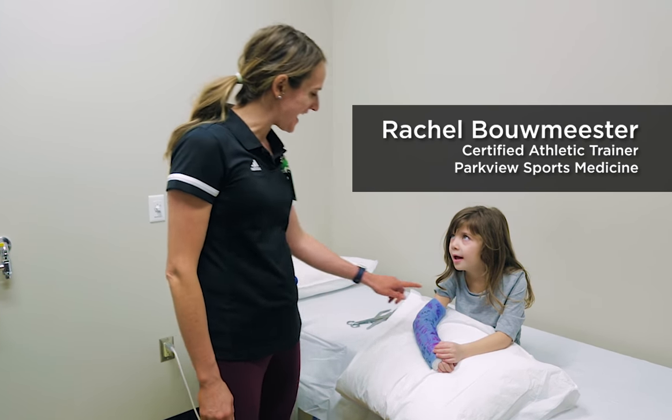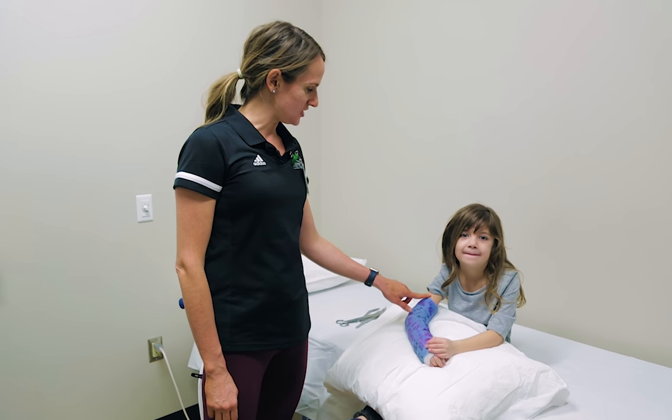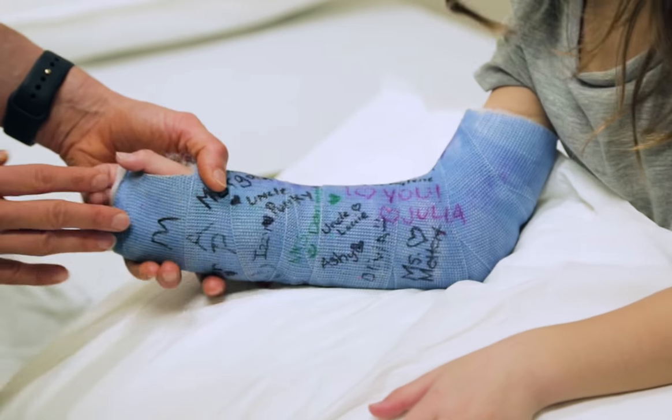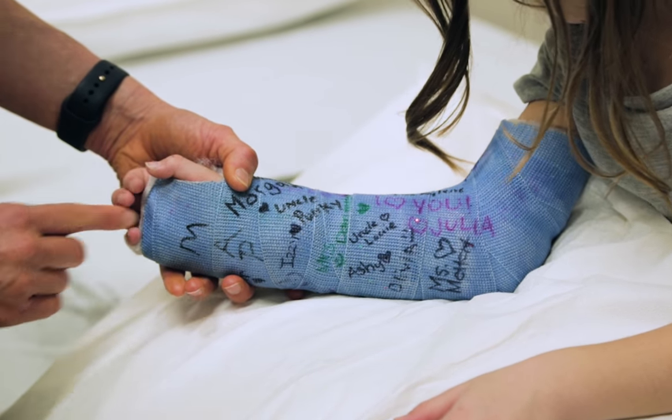I'm Rachel. I'm a certified athletic trainer and today we're going to take off Hattie's cast. It's a long arm cast. We go down here and then we're going to flip and then we're going to go down here and Hattie's going to keep her fingers all spread out nice and straight.